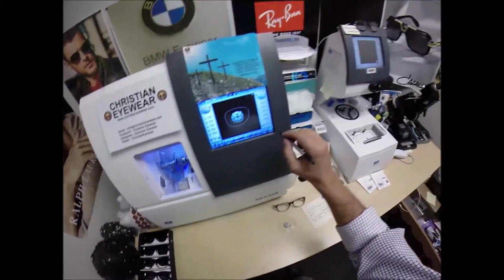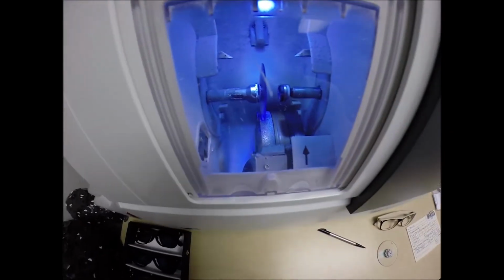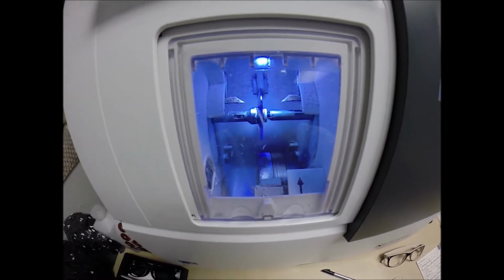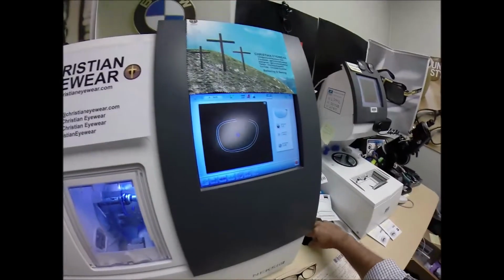They won't let me. All right, so I'm going to hit the green start button. The door closes. The clamp shuts. The lens is going to be traced by two white styluses, making sure that the lens on the first go-round is large enough to fit into the frame. And you can see as it's tracing the shape of the right lens.